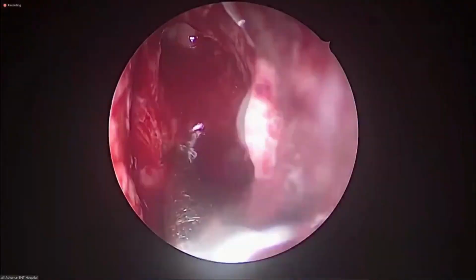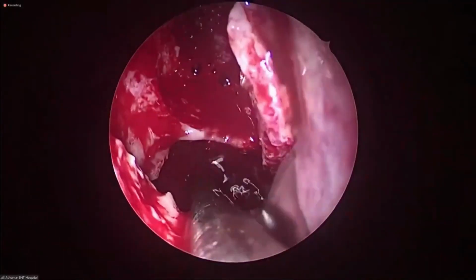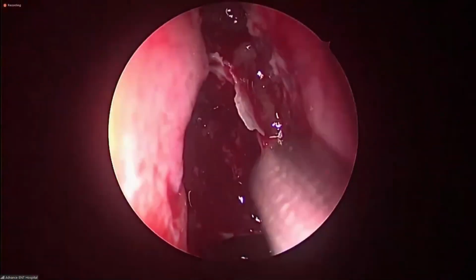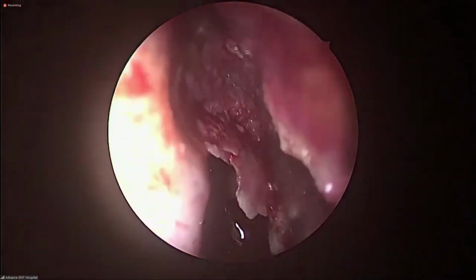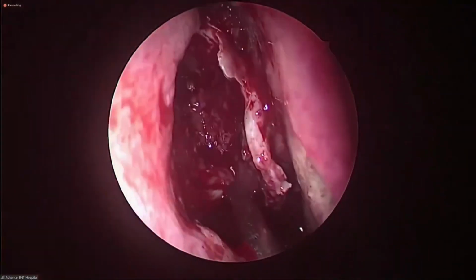That's the sphenoidal cavity, that's the lamina papyracea, maxillary sinus below. See this? Yes, sir. More and more anatomy is opening up. Yes. Go beyond. This is your part of the turbinate. And this is all eosinophilic secretion and disease. Yes. Right.